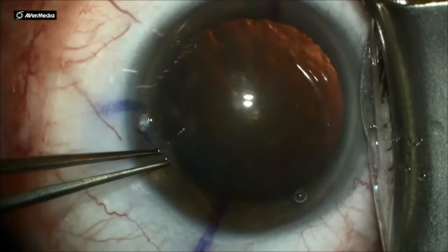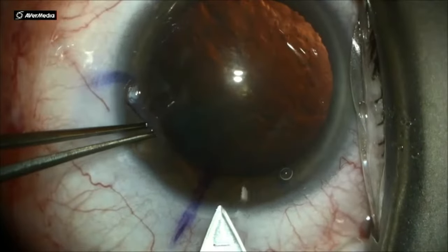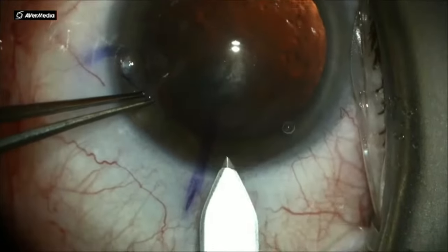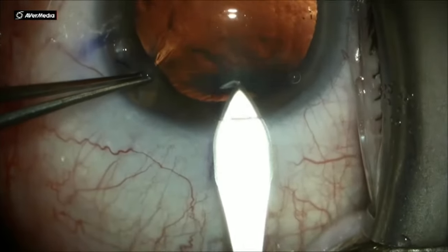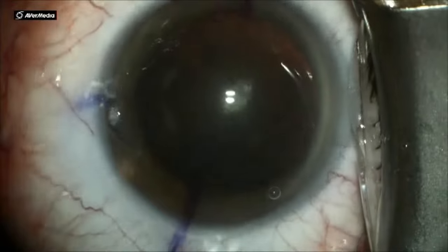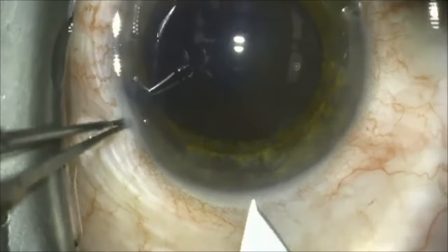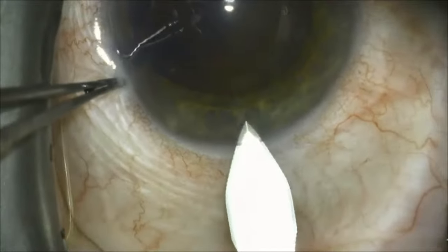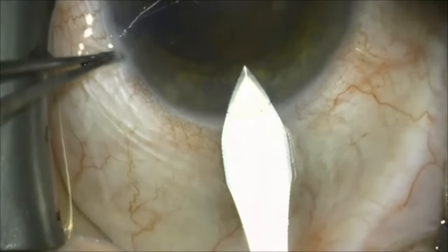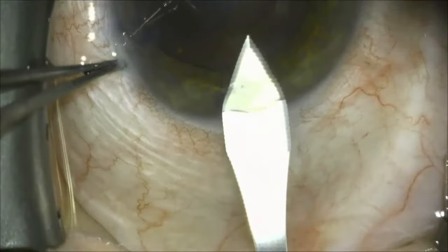The construction of the main incision is important in order to achieve a watertight incision. I create a beveled incision — I go up and then dimple down, and when I go up I purposely go in small steps so that when the incision is closed at the end it almost interdigitates together. I take my time and make tiny little steps up and dimple down.